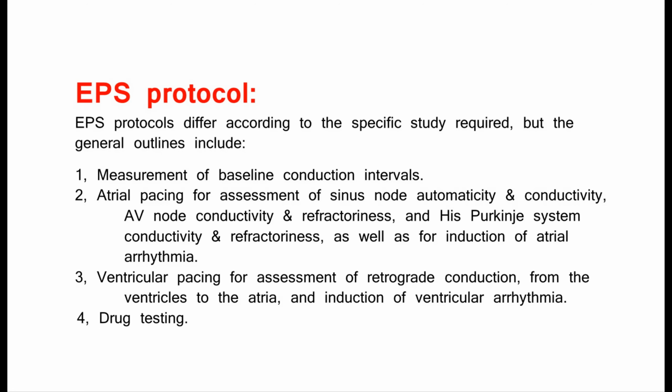EPS protocol. EPS protocols differ according to the specific study required, but the general outlines include: 1. Measurement of baseline conduction intervals. 2. Atrial pacing for assessment of sinus node automaticity and conductivity, AV node conductivity and refractoriness, and His Purkinje system conductivity and refractoriness, as well as for induction of atrial arrhythmia. 3. Ventricular pacing for assessment of retrograde conduction, from the ventricles to the atria, and induction of ventricular arrhythmia.